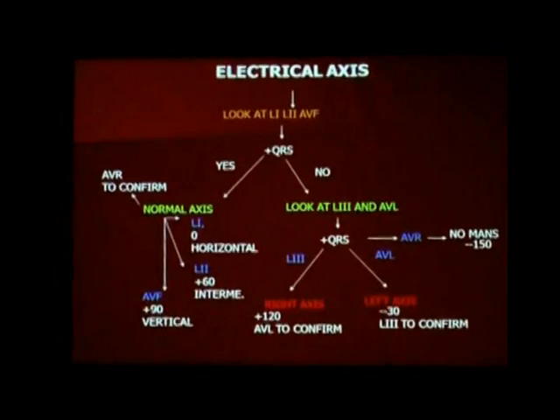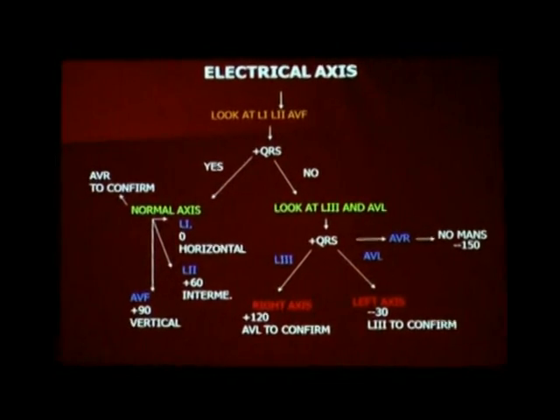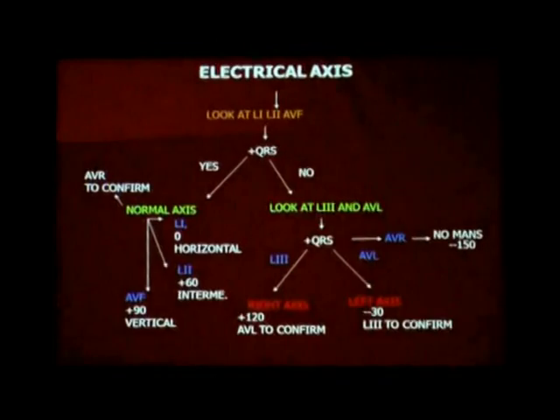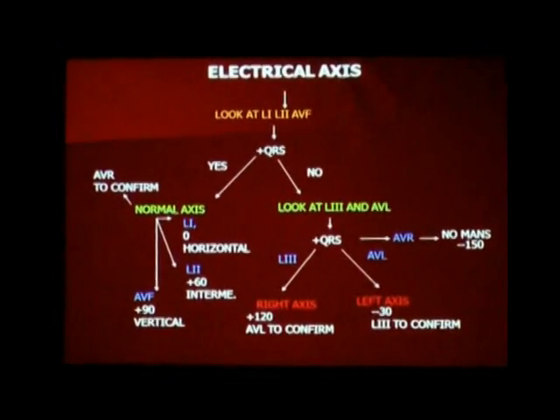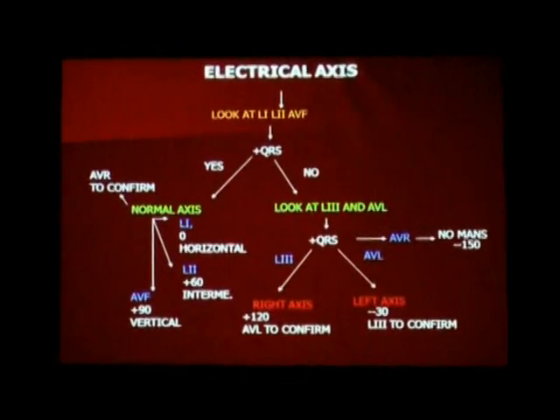Right? It's only 5 minutes. The axis is only a less-than-5-minute subject, so it's made to look so complex. So you should be thorough with the axis. Looking at the ECG, you know what the axis is. Right? Any doubts in axis? No. So the QRS is next; we have finished the axis.